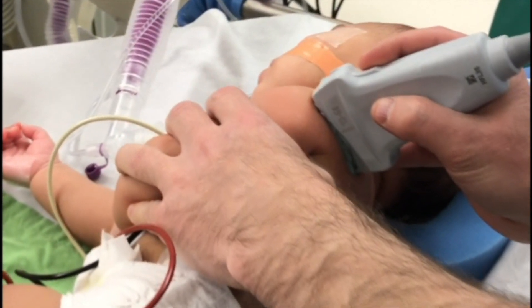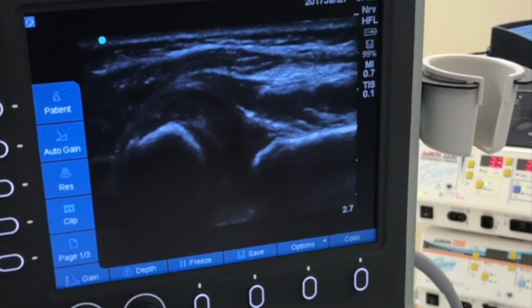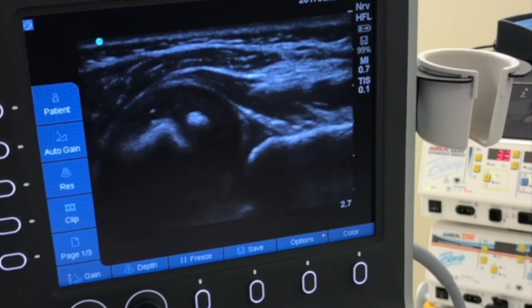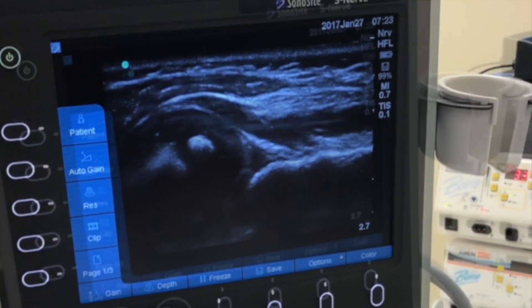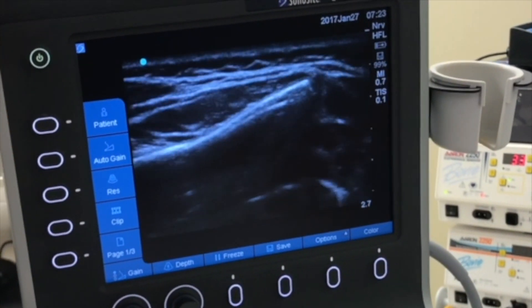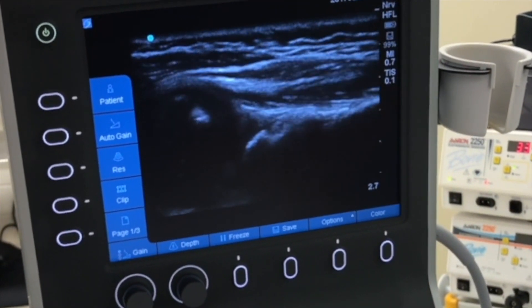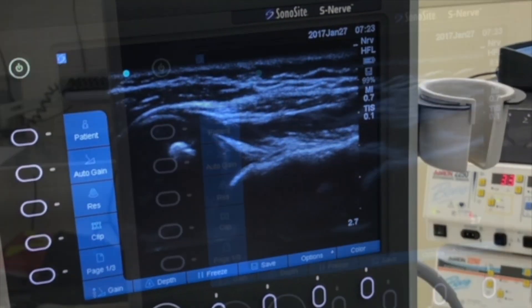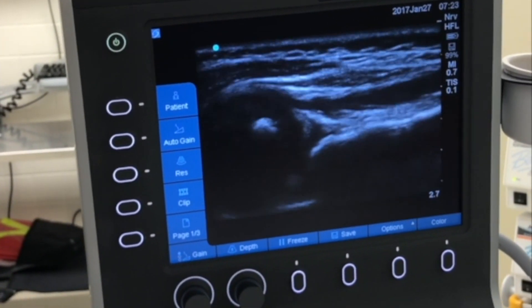Begin by performing an ultrasound in a lateral decubitus position. In this case, the ultrasound demonstrates severe glenohumeral dysplasia with a near dislocation of the glenohumeral joint. Because the child is only a few months old, the scapula has not yet had a chance to remodel and deform. Fortunately, the joint reduces with external rotation and some abduction.